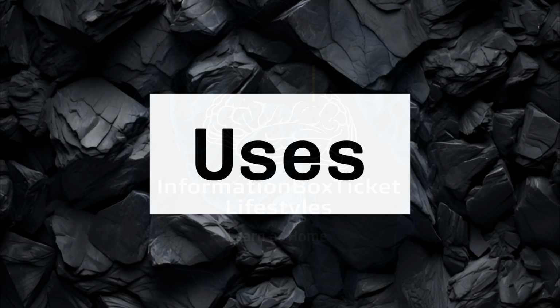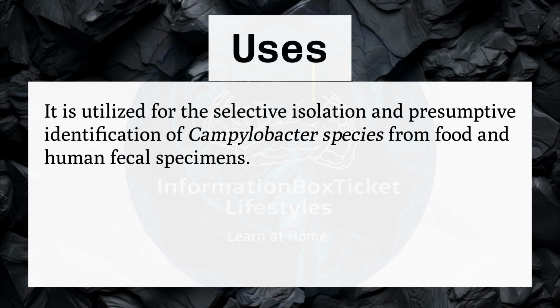Uses of charcoal selective medium. It is utilized for the selective isolation and presumptive identification of Campylobacter species from food and human fecal specimens.